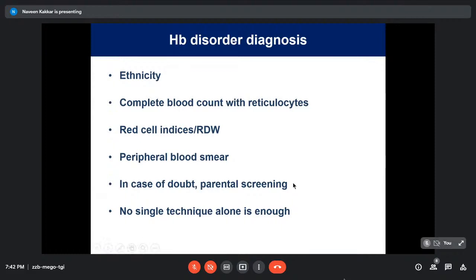It's a very important tool when you're stuck in figuring out what you are dealing with. And when we got HPLC and CMC many years back under a project, we thought we got the answer. In the next 3-4 months, we realized no, we'll still have to keep our electrophoresis going and even depend on other techniques. So remember, no single technique is enough. It will give you a lot of answers, but it will also throw up an odd question.